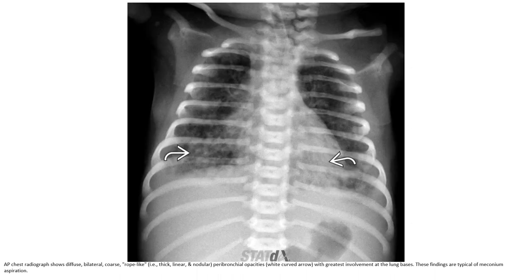Another radiograph demonstrates bilateral coarse rope-like, thick, linear, and lobular perihilar opacities with greatest involvement at the lung bases. This finding is typical of meconium aspiration.